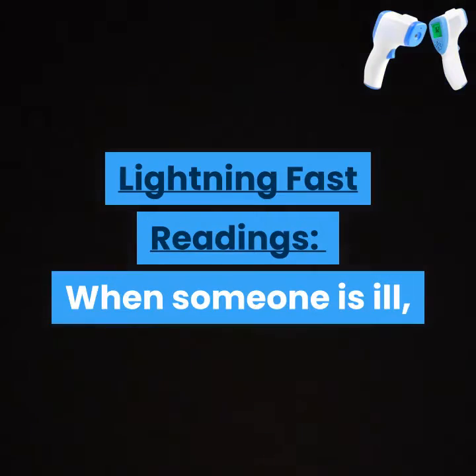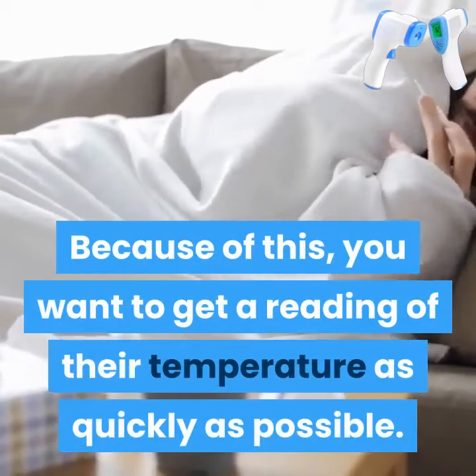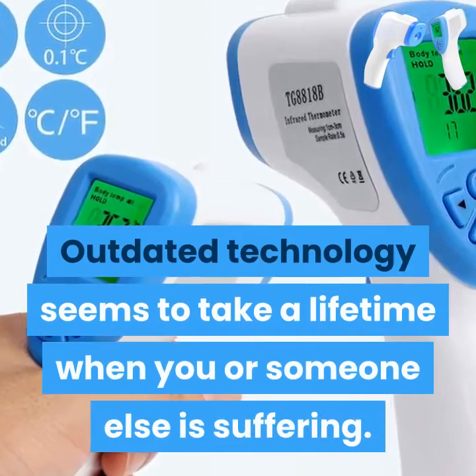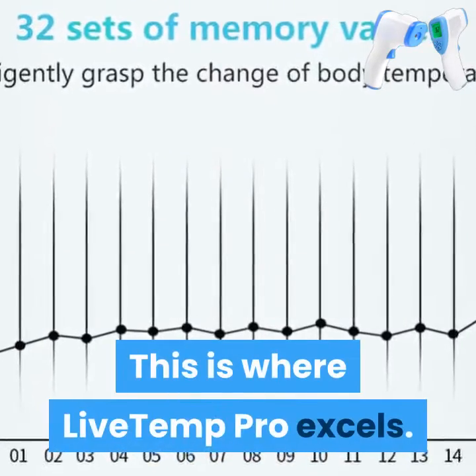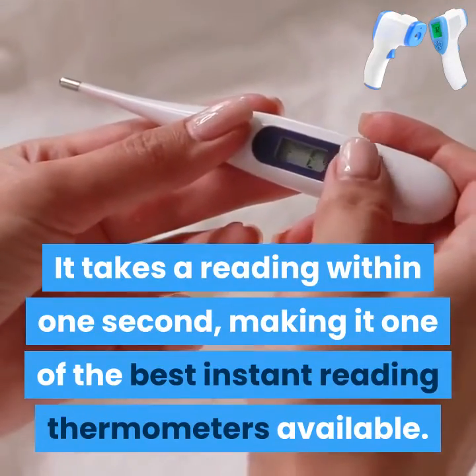Lightning fast readings. When someone is ill, you don't always know how severe things are. Because of this, you want to get a reading of their temperature as quickly as possible. Outdated technology seems to take a lifetime when you or someone else is suffering. This is where Live Temp Pro excels — it takes a reading within one second, making it one of the best instant reading thermometers available.